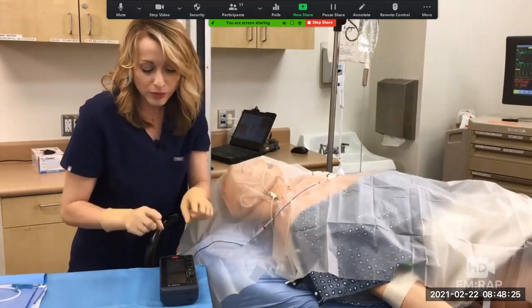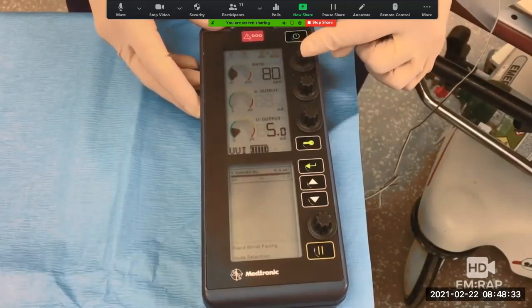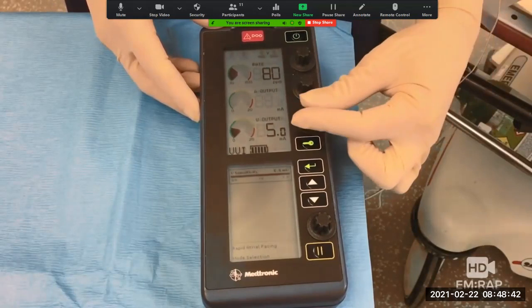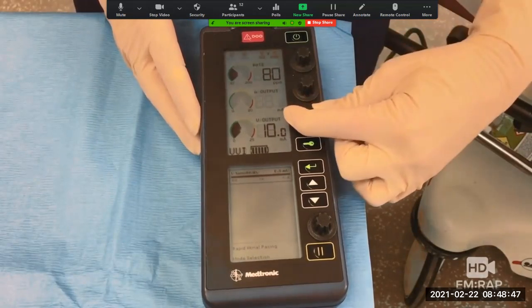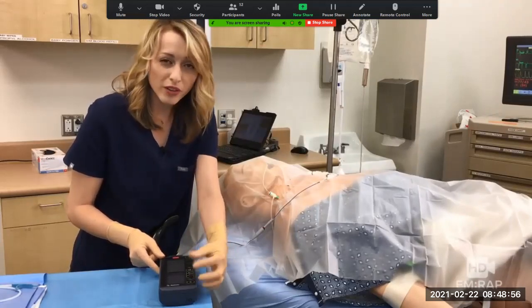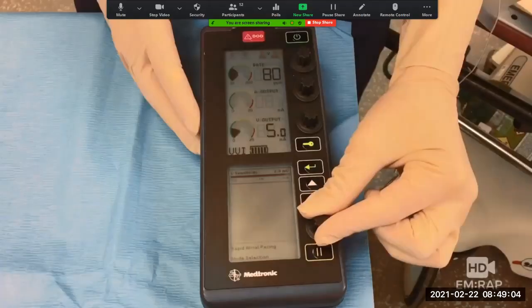We're going to set this up, have them turn on the pacing generator, and the rate on this one is set to 80. It's okay if you go slower than that, since their intrinsic rate is going to be much slower than that. We don't have to pace the atrium, we just have to pace the ventricle. So this one has options for both, but we're just pacing the ventricle. And I have the output set at 5 milliamps. You can adjust that if you want. You could go a bit higher if you want to turn it up. You can also change the sensitivity. The sensitivity here is set at 3, but if you are troubleshooting and picking up some sort of intrinsic rate, then you can turn that sensitivity down to 0. We're just going to leave it at 3 for now.